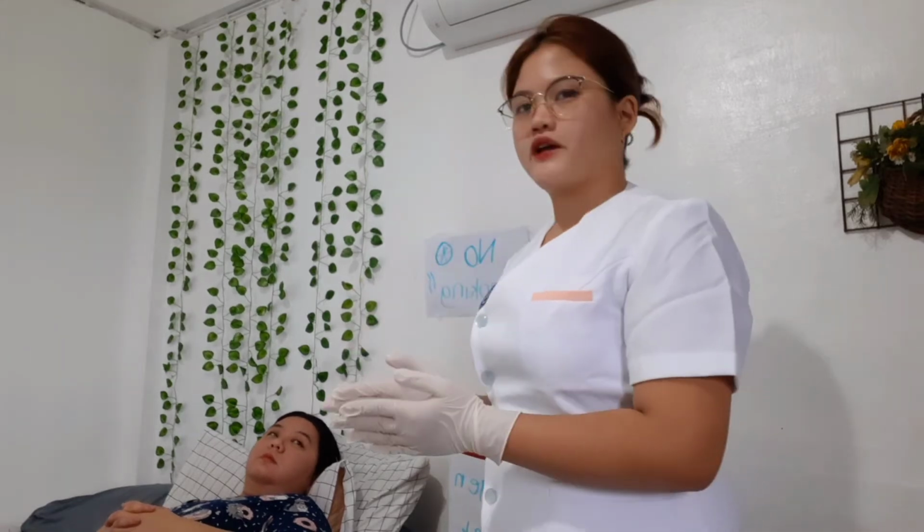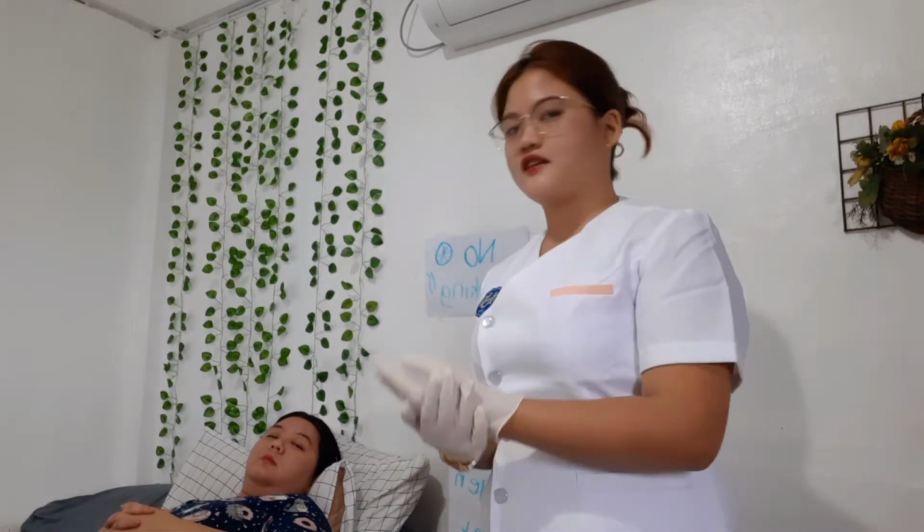So I have here already my gloves, and I will explain the procedure to the patient or to the significant others. So what is the rationale for that? It is in order to alleviate the anxiety and gain cooperation of the patient.